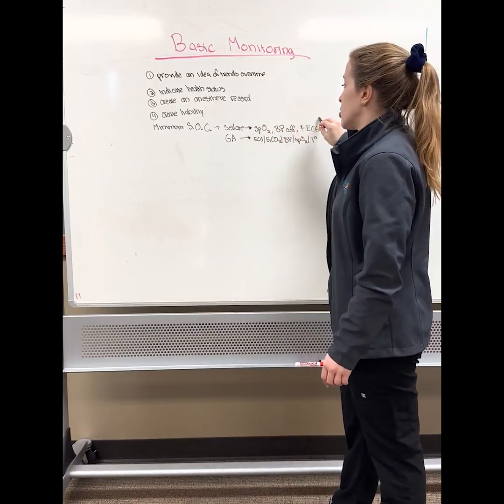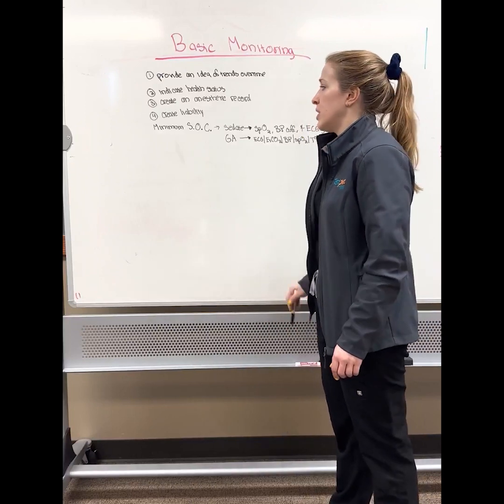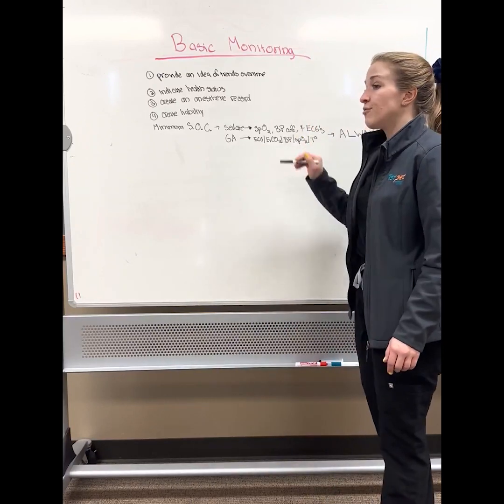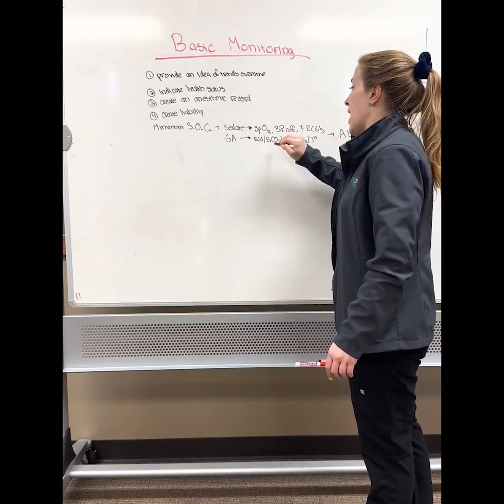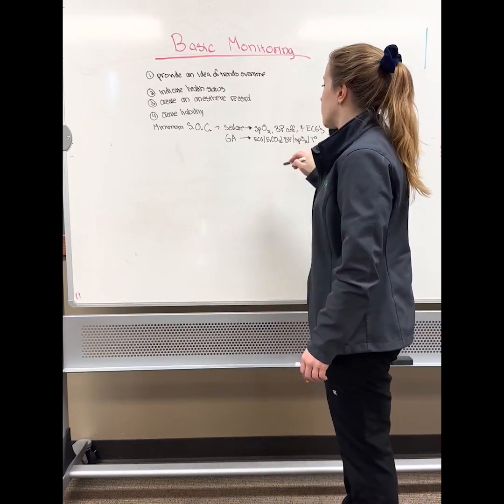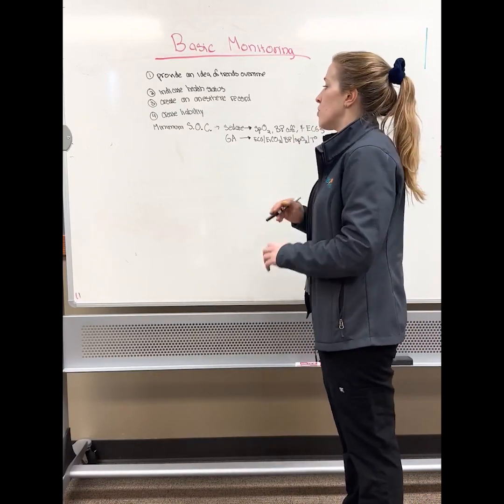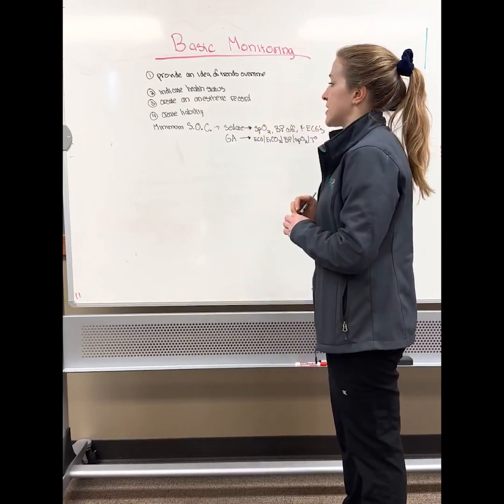And certain combinations of drugs will change the heart rate and change the rhythm, so try to do that as well. Anesthetized patients, everything goes on them: ECG, end-tidal CO2, blood pressure, pulse ox, temperature. The blood pressure measurement can either be non-invasive, Doppler, or invasive. So the minimum standard of care is to put on some monitoring.